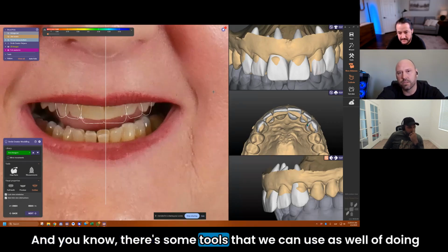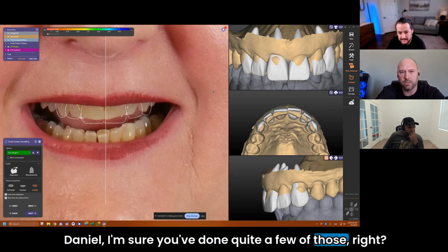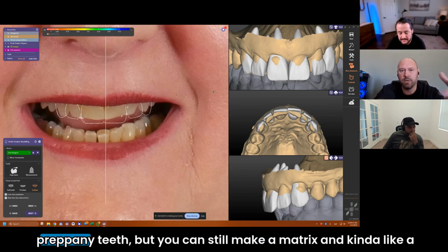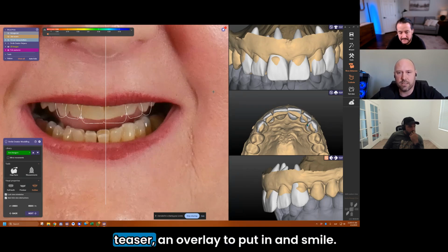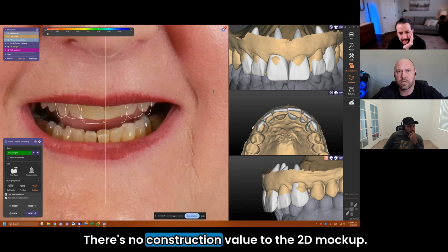And there are some tools that we can use as well for doing an overlay. Daniel, I'm sure you've done quite a few of those, right? Where you don't actually prep any teeth, but you can still make a matrix, kind of like a teaser, an overlay to put in and smile. But yeah, I'm with you. There's no construction value to the 2D mock-up.